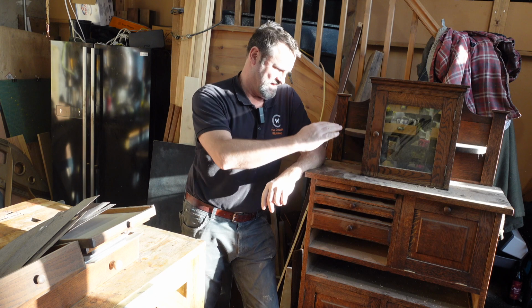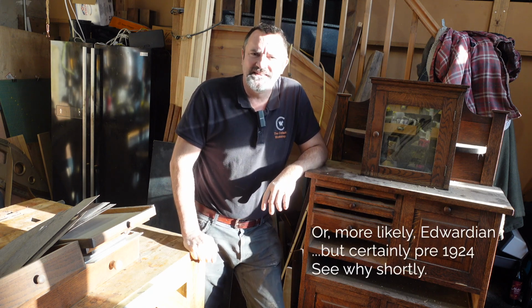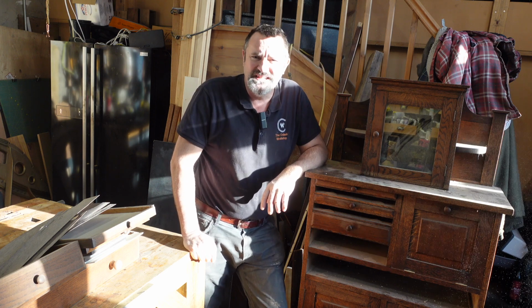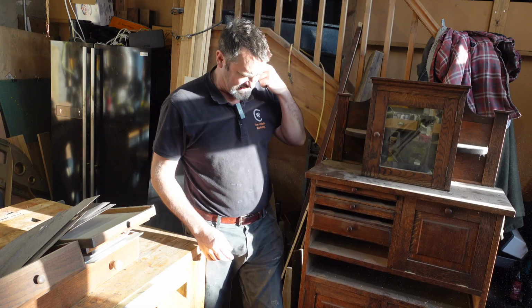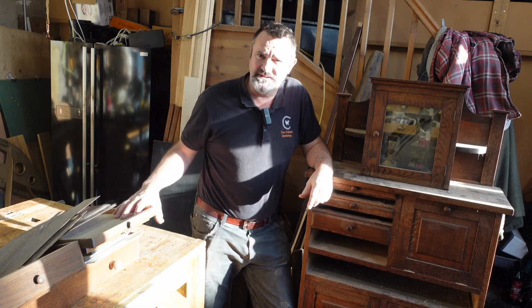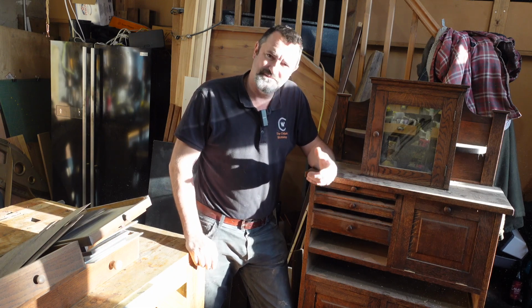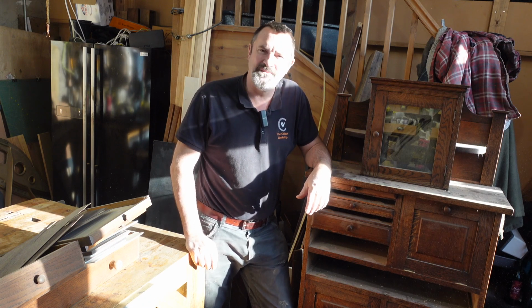Today we've got this Victorian dentist's cabinet that needs to be restored. It's a bit dusty and has warped and moved over the years, and we've got a box of bits that needs to be put back together. So I'll take you through what needs done and we'll get it restored. Hope you enjoy.